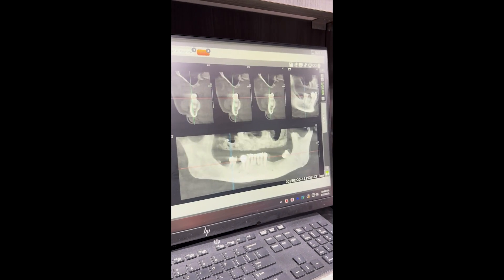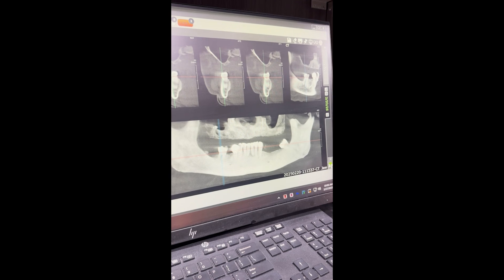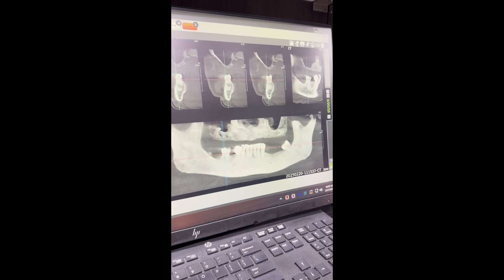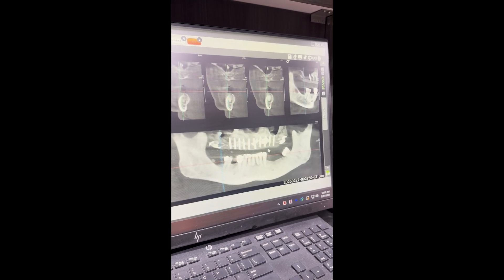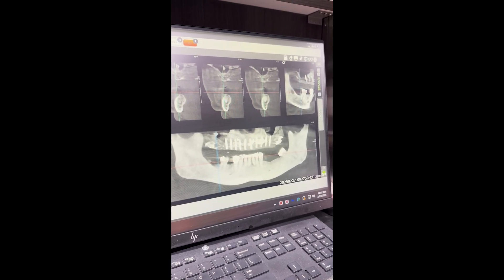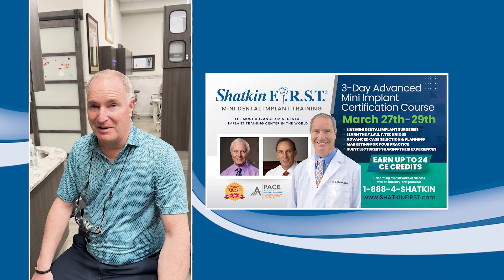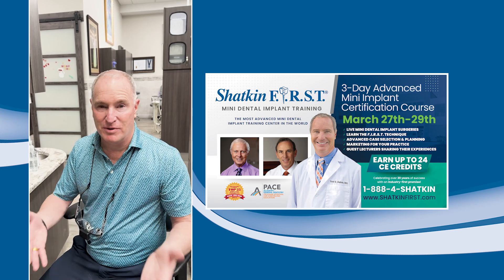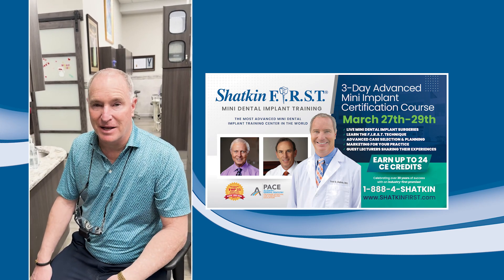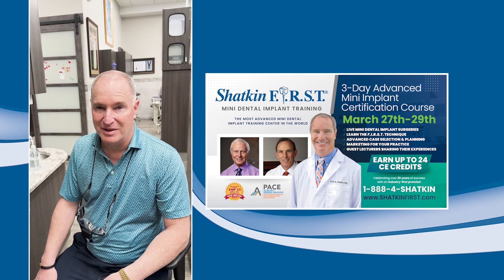I'm going to show you the pre-op again. There's the pre-op x-ray — you can see the low hanging sinuses, so we stayed anterior to those for the most part, and we're in good shape. Thank you for joining us on this Monday Morning Minute. Don't forget to join us here in Buffalo at the end of March with Dr. Gordon Christensen and myself — we'll be presenting advanced mini implant cases and lectures. We'd love to see you here in Buffalo.